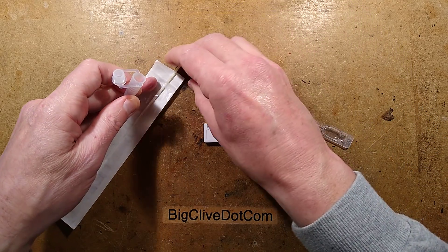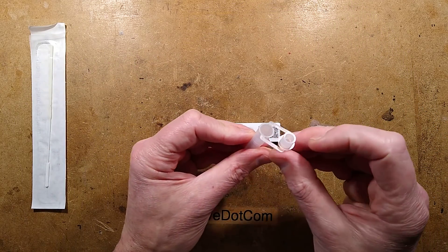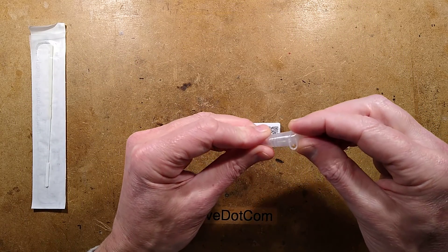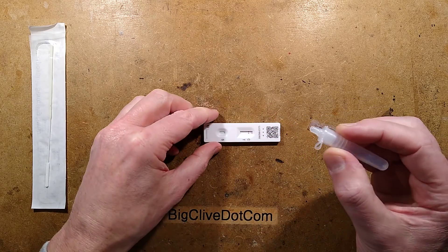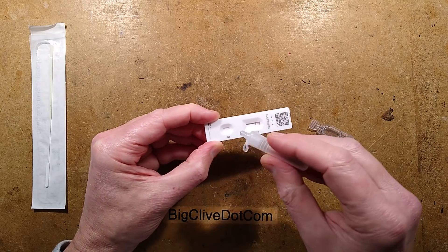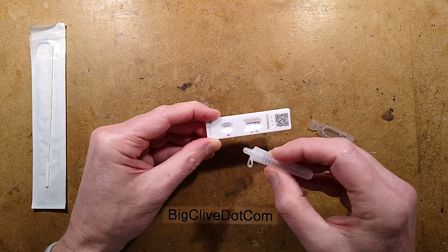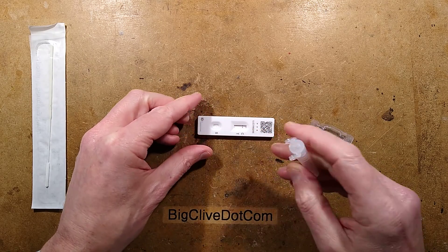I'm keeping this pad. I'm not going to contaminate it because I want to keep that test. Then you pop this lid in and you have a little squeezy dropper bottle. Quite clever.